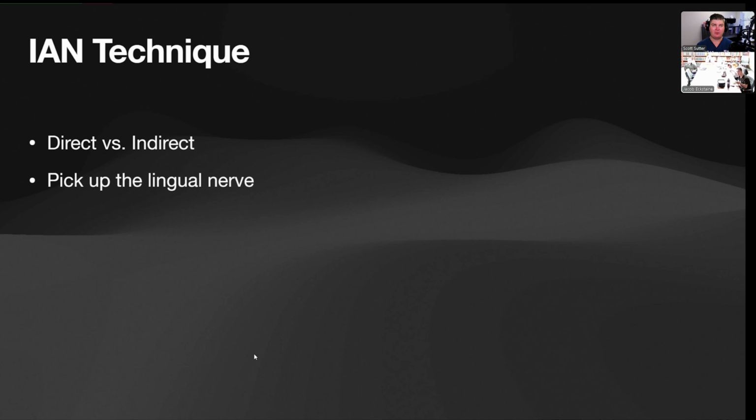But you want to make sure you pick up the lingual nerve. You all know how to do that. As you're going in, stop at about a quarter inch in, deposit a quarter of the carpule. That'll usually pick up your lingual nerve, no problem. And I recommend using lidocaine for this.